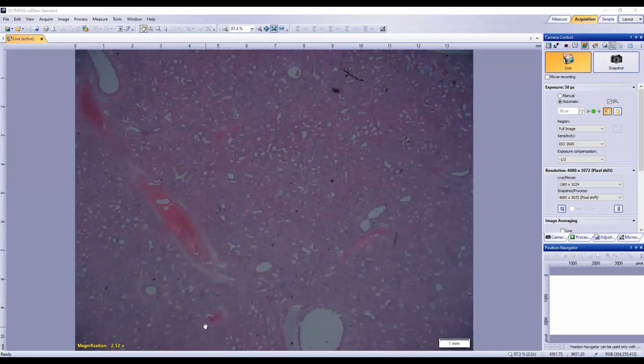Fibrous connective tissue. Yeah, neutrophils, and before we get to the connective tissue there'll be a little bit of that. Lymphocytes, macrophages, and then on to our fibrous capsules. So I generally structure my abscess description with a central thing surrounded by a thing surrounded by another thing. In this case, it's our necrotic material, and we've got all our descriptors for that.